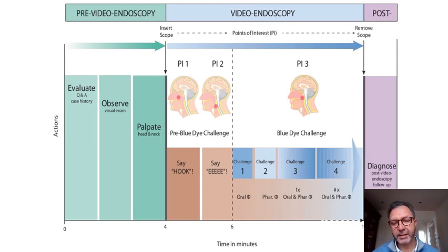You can test the sensibility of your pharynx and larynx. You can also saturate your patient by asking him to swallow several sips in a row. You can also challenge different scenarios that you suspected before. And after doing that, post endoscopic examination, you should be able to code the fibroscopy of your patient.